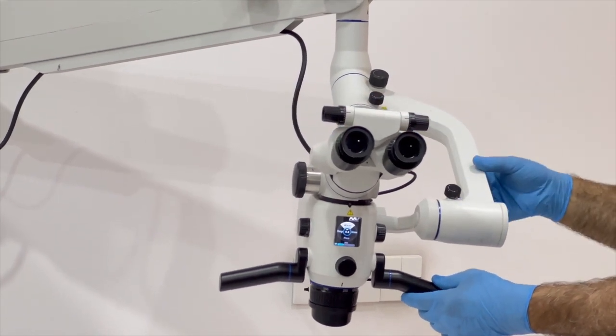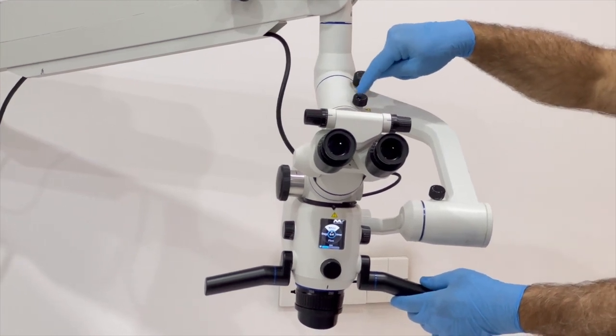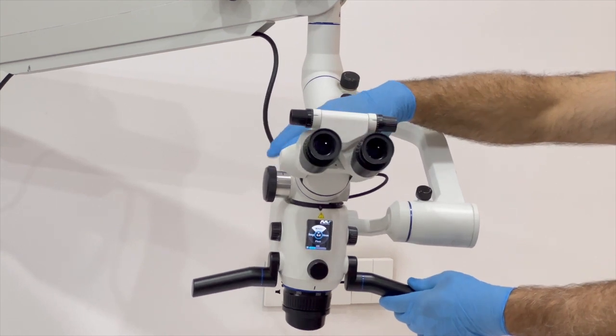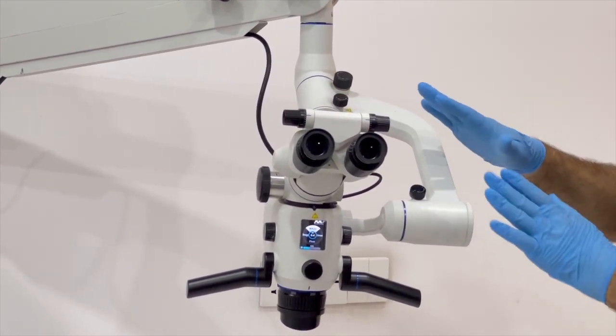Okay, so we have lateral rotation, which is tightened by this screw, and anterior posterior rotation that is controlled by this screw. This is the first part.